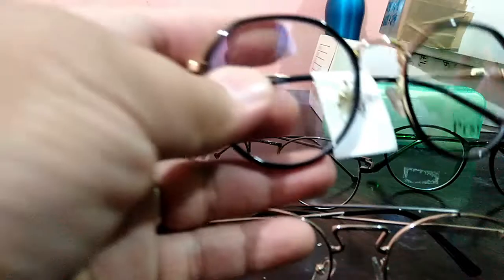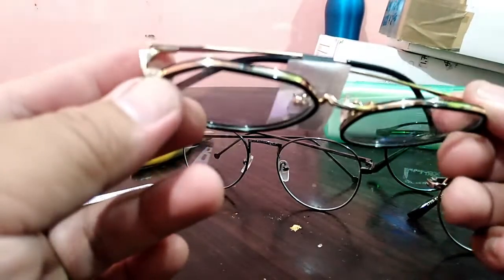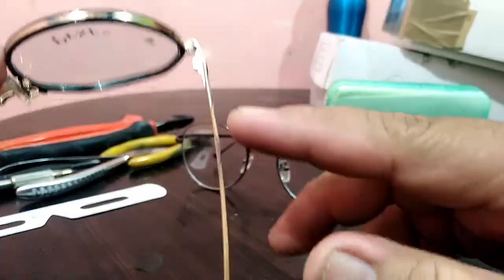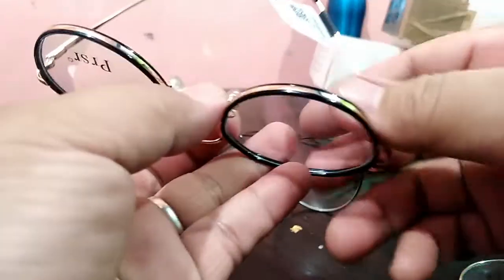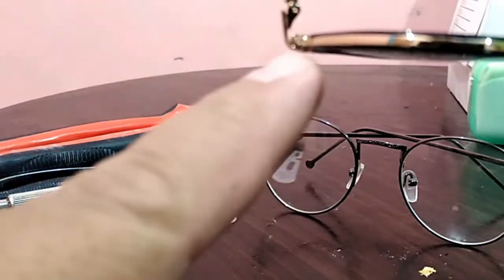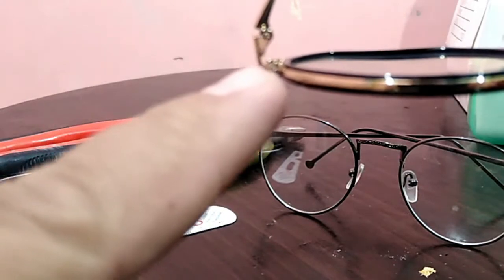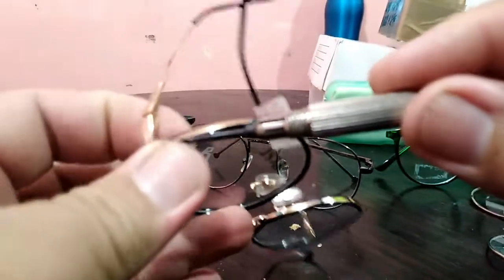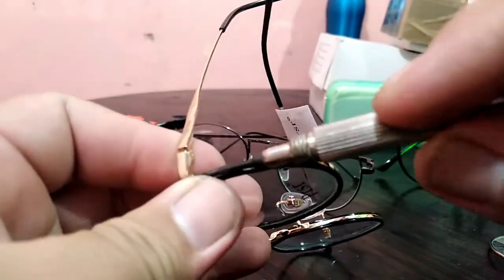As you can see on this frame, there are screws here in this area. So you can use your screwdriver — to open the frame you just unscrew and open it.